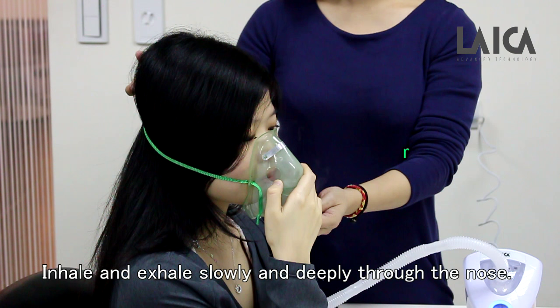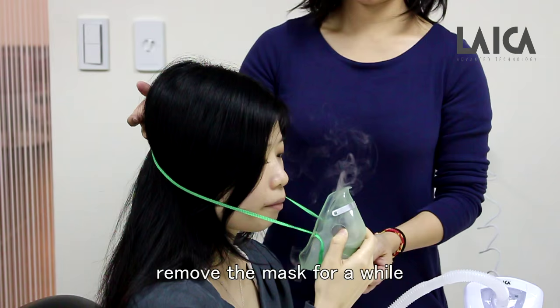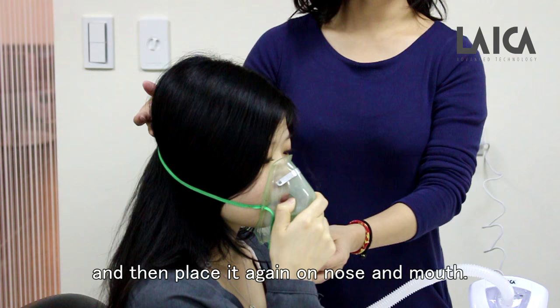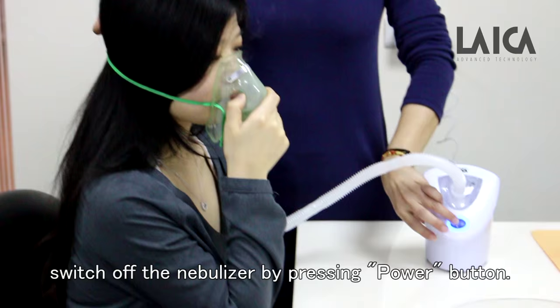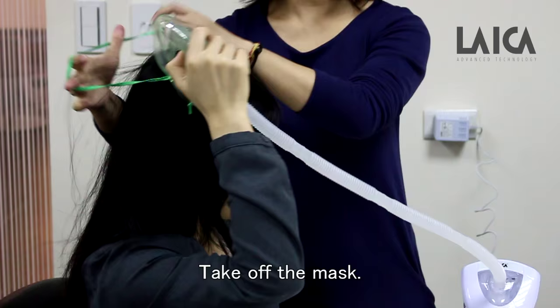If you wish to interrupt the inhalation shortly, remove the mask for a while and then place it again on nose and mouth. When the therapy is finished, switch off the nebulizer by pressing power button. Take off the mask.